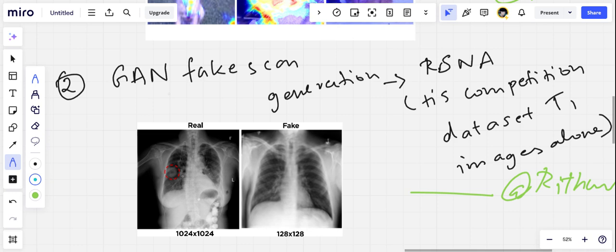But if the patient had only 7 scans, we have two options. One is to leave the remaining 3 as empty images. But that will affect how the model is working because we don't know which part of the spine the 7 images were taken and so on. So the better idea is to scale up the 7 images into 10 images, generating an image similar to any given images in the scan. We can use this generative adversarial network, which generates extra images for the same patient.